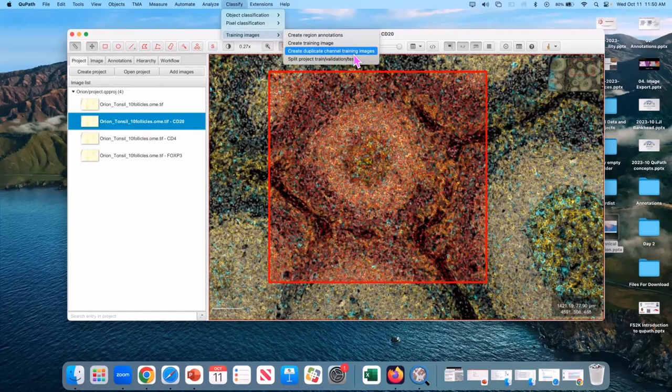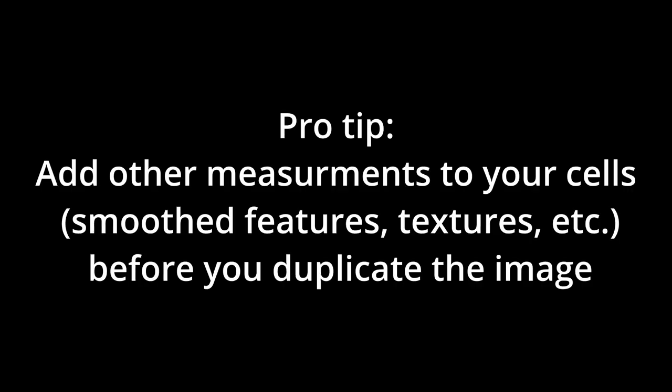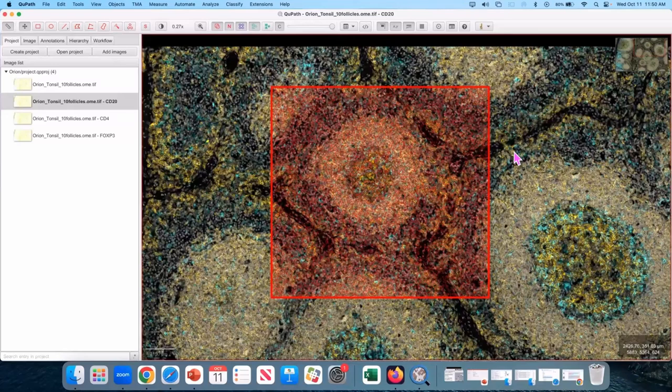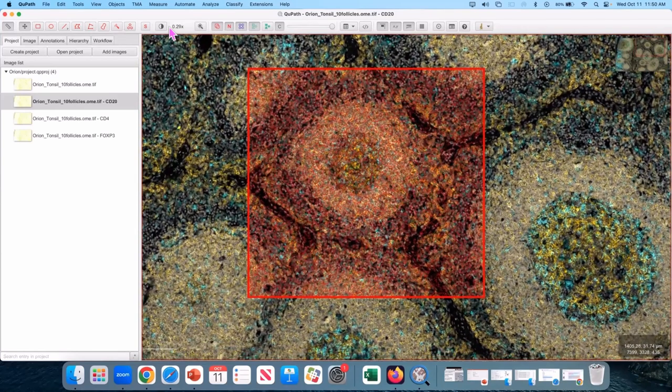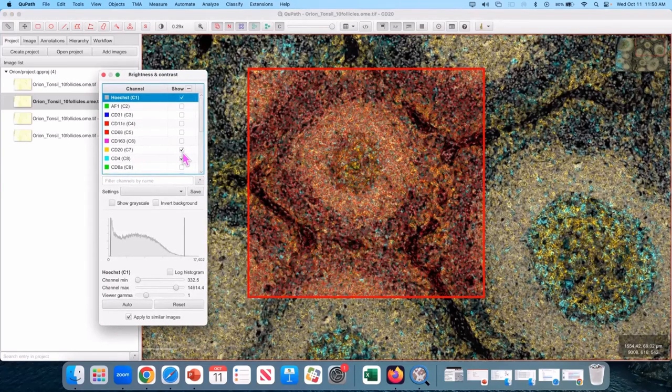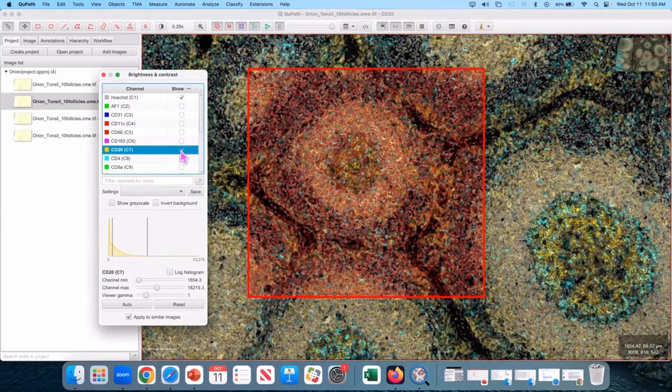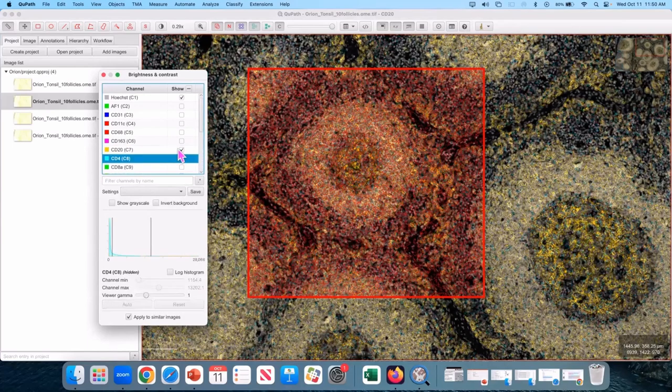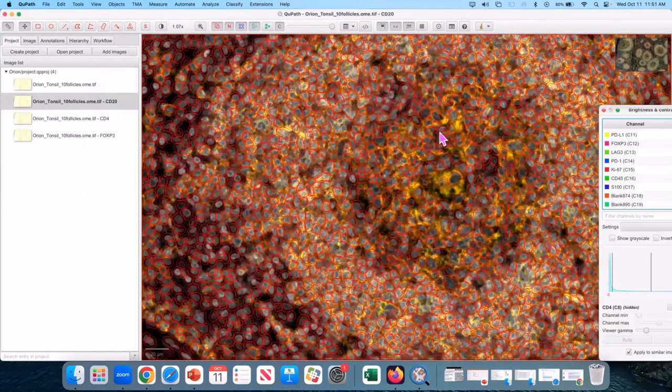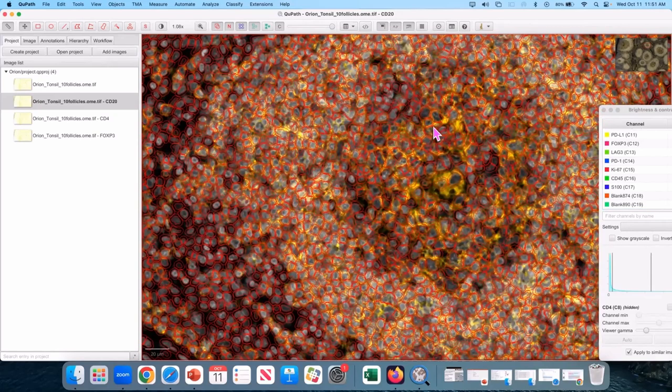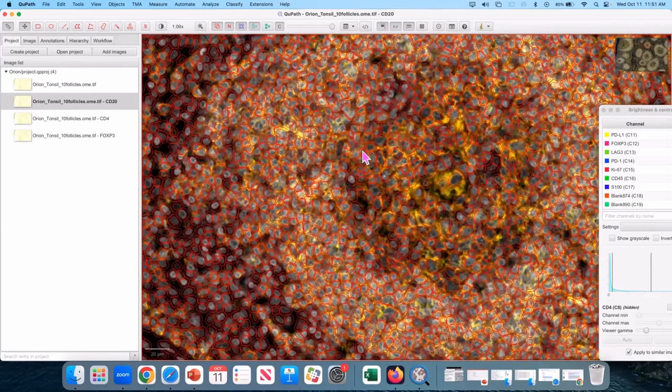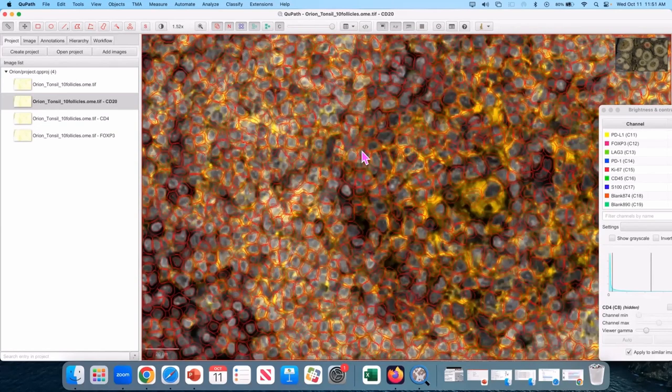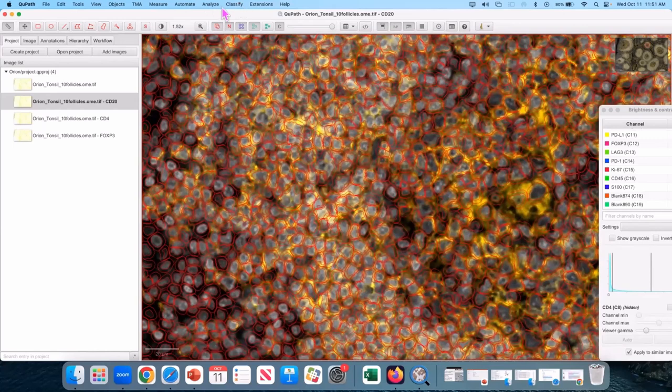Classify training images, create duplicate channel training images. And I immediately regret not making more measurements. As long as you've saved yourselves first and they'll be in every one of your files. From here, I'm going to turn on my first channel and I'm in the CD20 image. I'm going to turn on CD20 and I'm going to turn off everything else. And then I'm going to make a CD20 classifier. You could do this however you want. You can make it a single threshold if you think that's going to be good enough. You can make it a trained machine learning classifier if you want to do that instead. That's what I'm going to demonstrate here because I think it works out a little bit better.